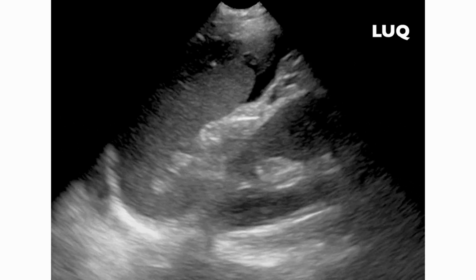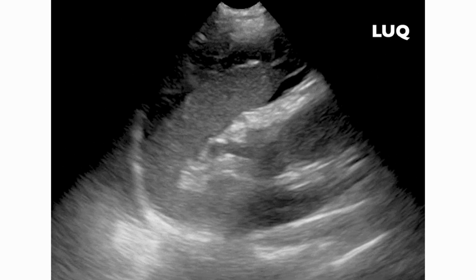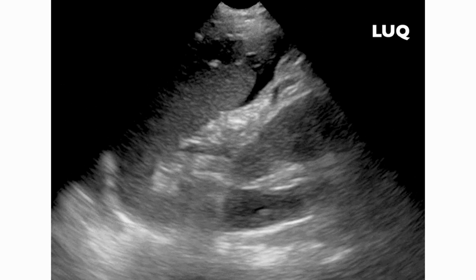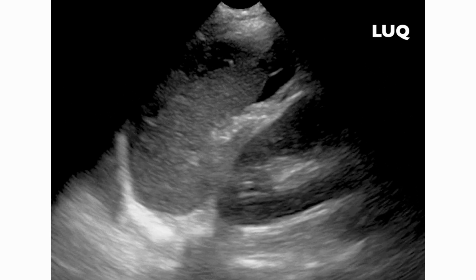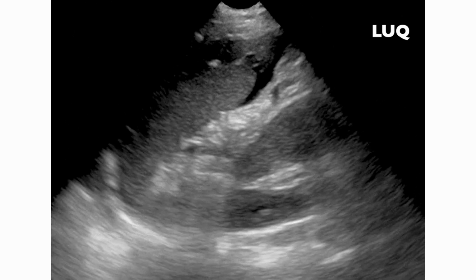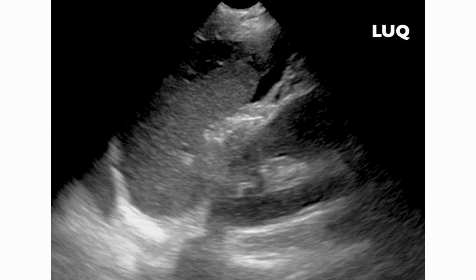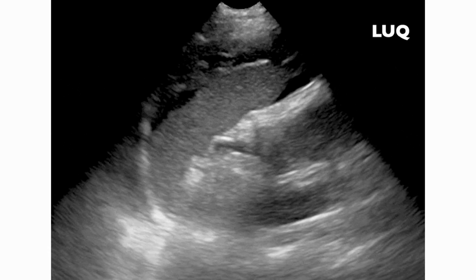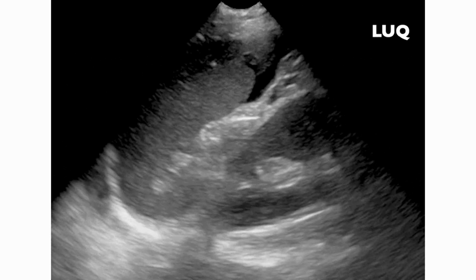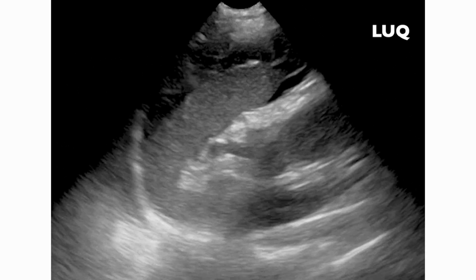So this view would be a left upper quadrant view. It's very obvious because it's labeled there. We see the spleen. We see hypoechoic black surrounding the spleen. We also see some other muckiness in that area. And that can just be different densities of blood. It could be splenic tissue, a parenchyma. If the blood's been sitting there a little bit, it will coagulate and actually cause more hyperechoic densities. And below that spleen, we see the kidney. So it looks like hemorrhage within probably the capsule of the spleen.